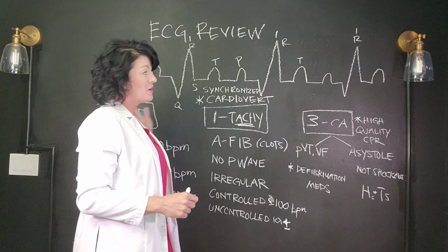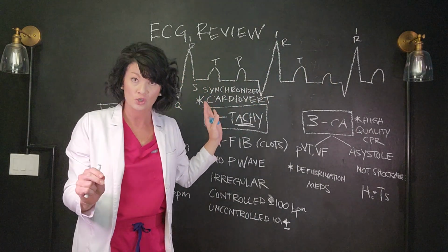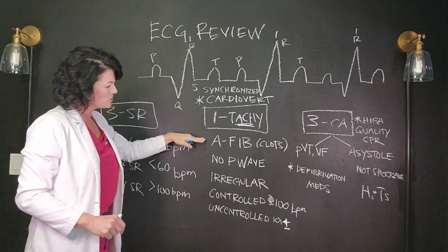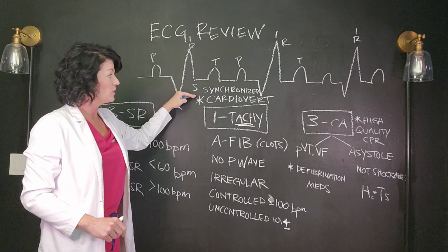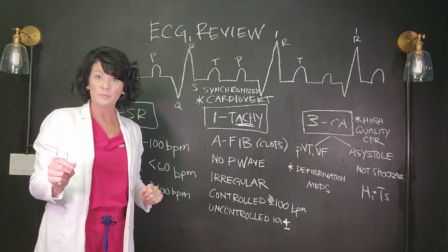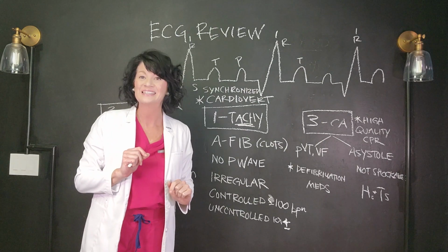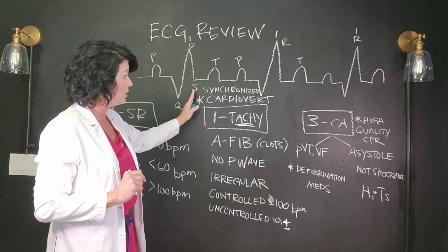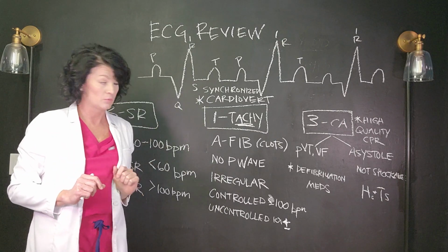If we give it anywhere else through the cardiac cycle, there is a possibility that we could kill the patient, okay? But keep in mind, a patient that is in uncontrolled AFib is conscious. So when we are going to cardiovert the patient, synchronized cardioversion, we want to consider potentially sedating the patient. Okay, so synchronized cardioversion hits on the R wave, and we do it for our tachyrhythms.